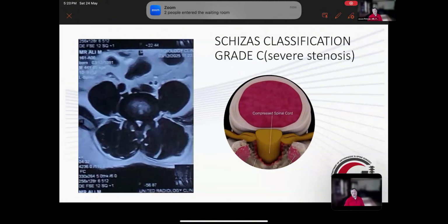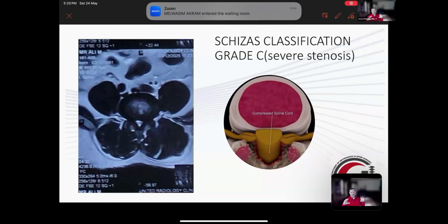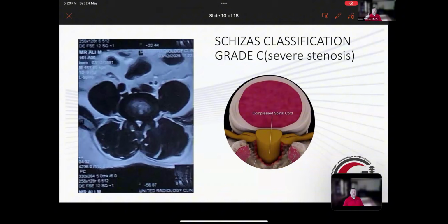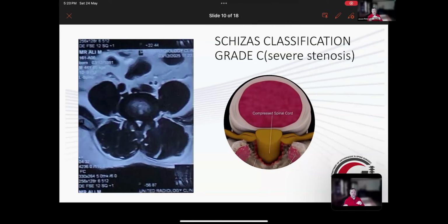Ultimately, you just have to ask, can I achieve the end result with the tool in my hand? It doesn't matter which of the two techniques you use, as long as you're able to achieve the surgery that's in front of you. The argument in favor of the uniportal technique is that it tends to be interlaminar rather than what I will call translaminar with biportal, where you actually do a hemilaminectomy.